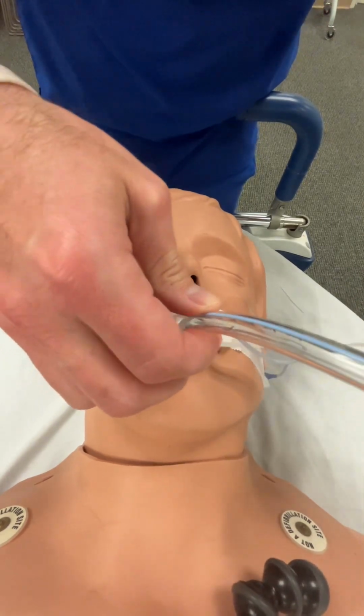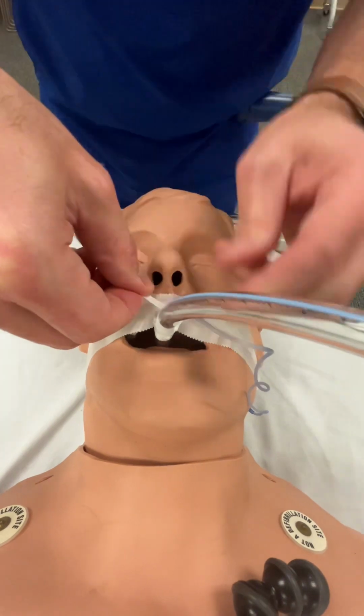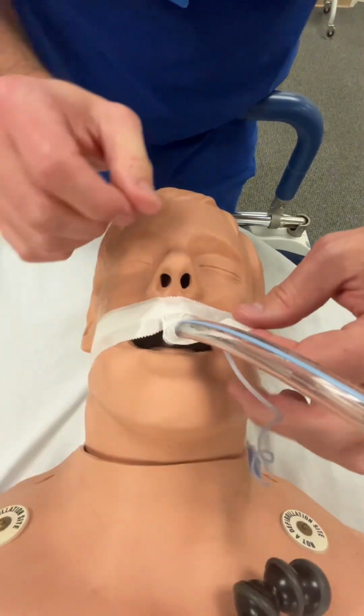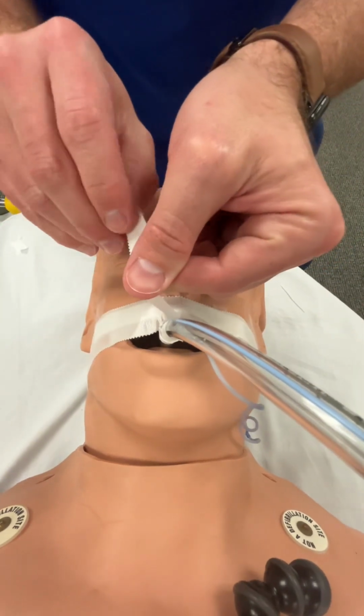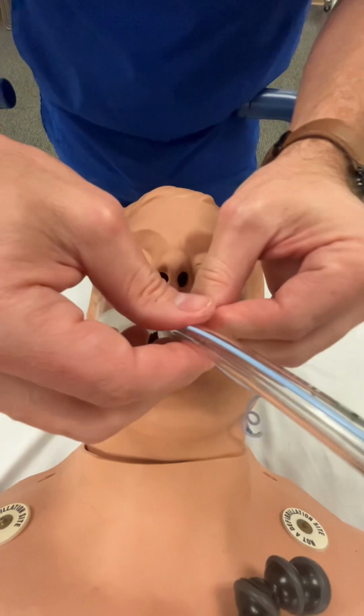Again, you want to avoid taping up your pilot balloon. And of course, you're going to have an extra set of hands on here, so I'm just trying to keep my hands out of the way for the video. So you're going to candy cane it up like before, and then you're going to make your courtesy tab. And make sure when you're wrapping it around close to your lip that you're not actually pinching your lip.